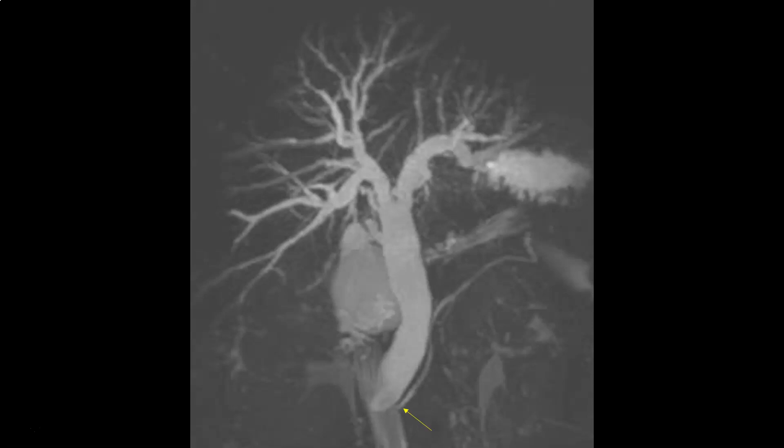We can see the pancreatic duct joining the lower end of the common bile duct as expected normally. We are having two communicating ducts — one of them is dilated and the other is not — and to explain this situation we have two scenarios. Either we are dealing with an obstructing malignant neoplasm of the lower end of the two ducts, that's to say at the ampulla of Vater or the pancreatic head, but in this case we cannot explain why the pancreatic duct is not dilated.